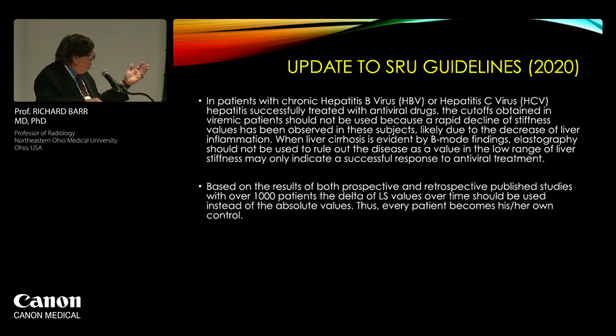And again, I mentioned this again, it's really important that you realize when people are treated, oftentimes the treatment is not resolving the fibrosis, it's resolving the inflammation. Then our cutoff values don't work. You have to go after they're treated, get their own baseline, they become their own reference standard, and then you look at the delta change over time, and that's really helpful. And again, this is useful for almost anything that we do. In fact, even congestive heart failure.